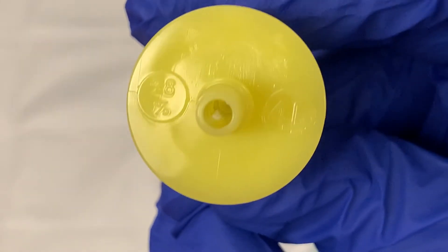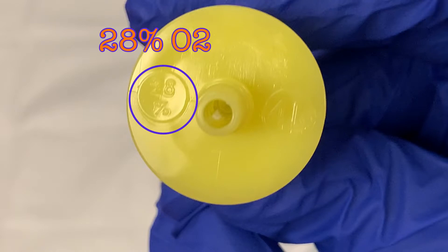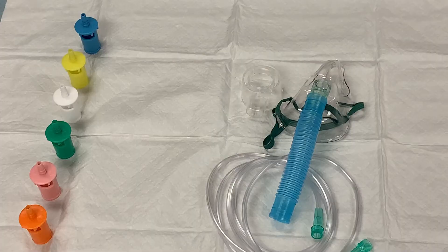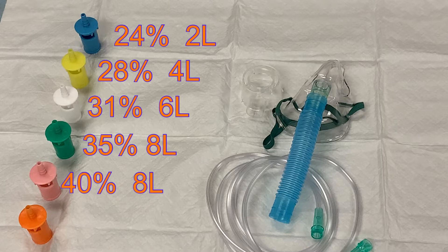If you look at the top of the adapter, you will be able to see what percentage of oxygen it is designed to deliver and how many liters of oxygen it will require. This yellow adapter delivers 28% oxygen and requires 4 liters of oxygen flow. The included adapters can deliver 24, 28, 31, 35, 40, or 50% oxygen to the patient when receiving the appropriate flow of oxygen.